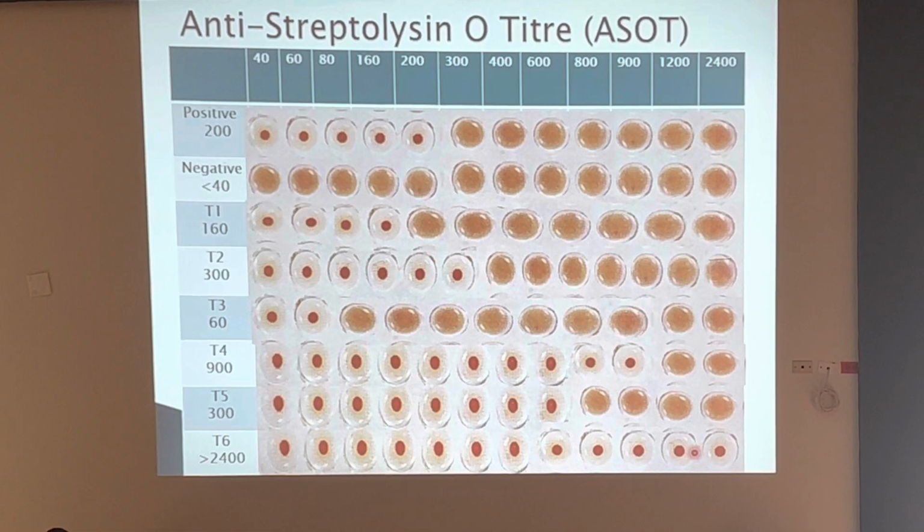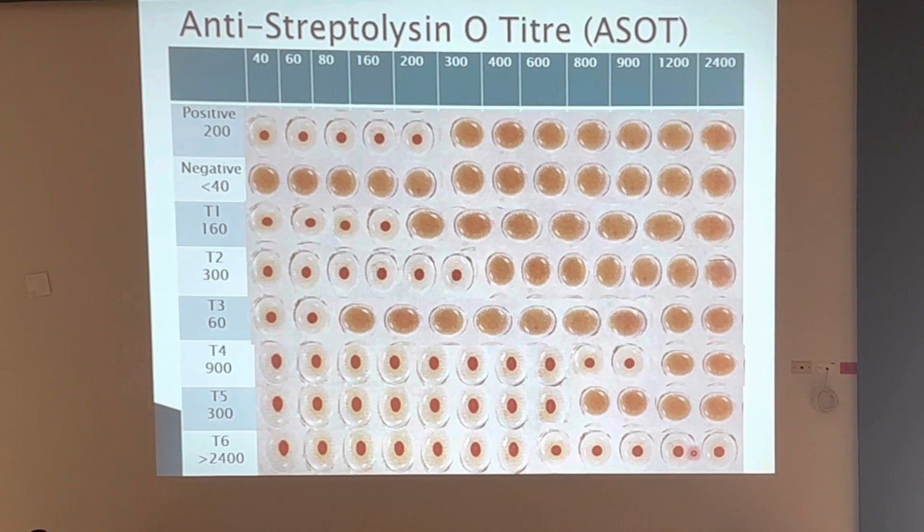There really is no need to continue with that dilution in any place, because that means that your patient has a very high titer. What you need to do now is start treating to get that titer down. Go ahead.